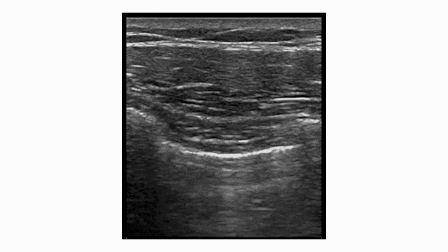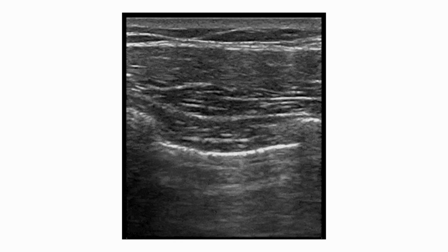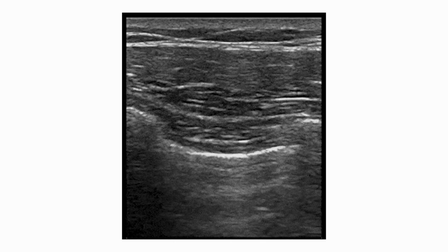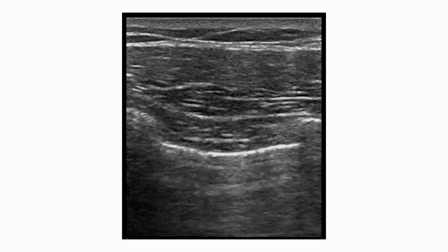But this would be a sign for positive lung slide, which would be indicative of not having a pneumothorax in that area. And on both sides of that bright white line, we can see the ribs. So we see there's subtle bright white densities that have shadowing behind them that we can't see anything, and those are the ribs.